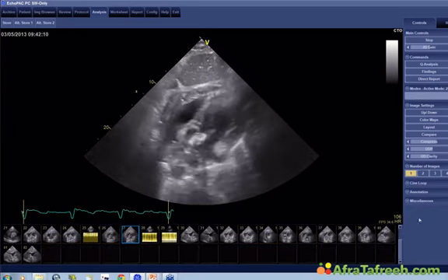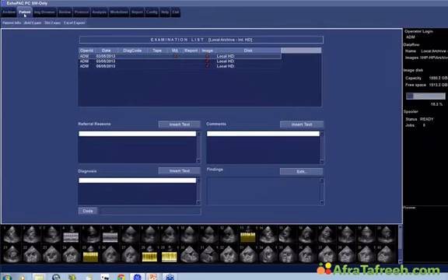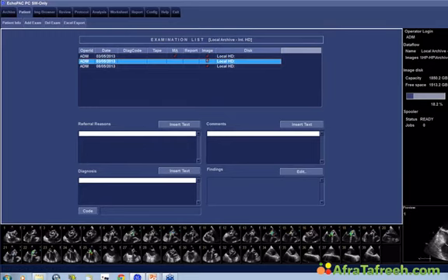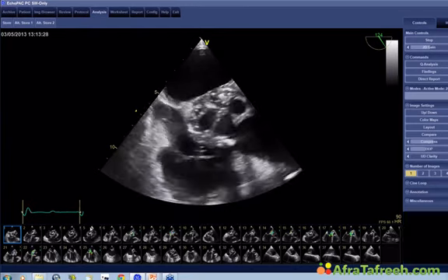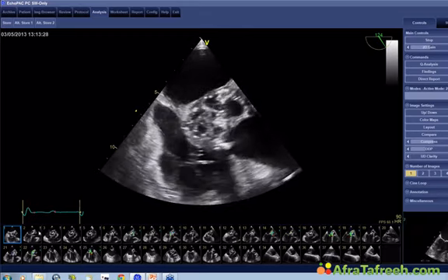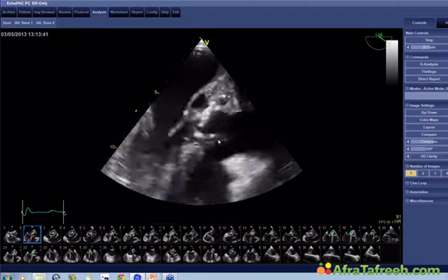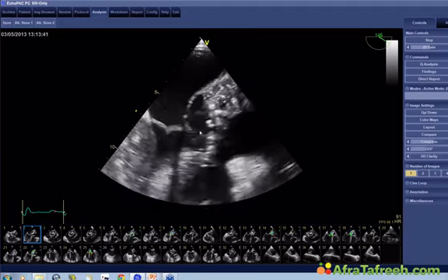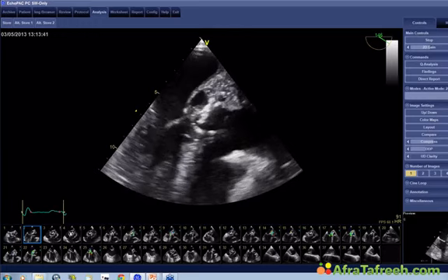So, in my view, in this setting, you must perform a TE study, even though I would be almost 99% sure that it is some form of endocarditis. But the finding that we found with TE was just spectacular in a negative sense. This is the TE study. What you have here is the aortic valve, and the aortic valve bounces back and forth. It's probably congenitally abnormal, but what is even more interesting is the surrounding of the aortic valve.